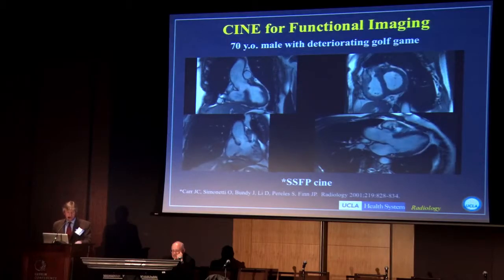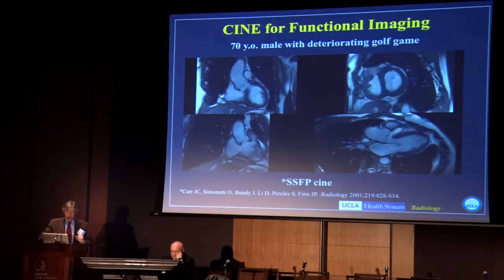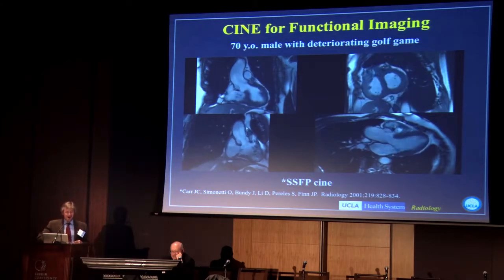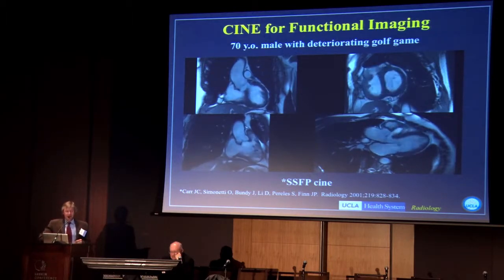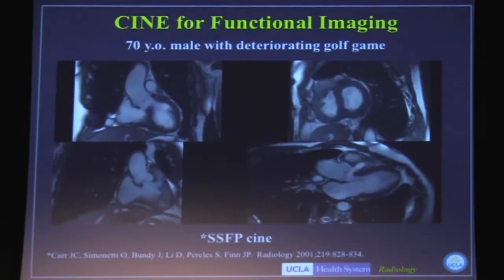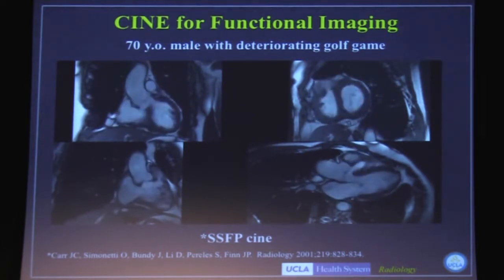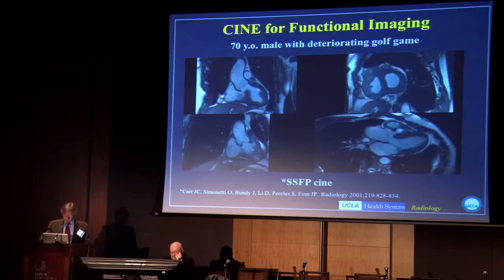On CINE imaging, here's an example. This patient presented acutely with a deteriorating golf game, but had more of an excuse than most of us. As we can see, this is a perfect example of untreated tetralogy of Fallot. We can see all of the features here on CINE imaging. This technique has been around for quite a while — we developed it originally at Northwestern, and now it's pretty much used everywhere.